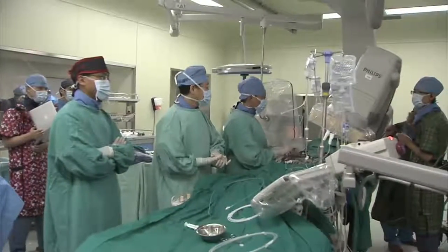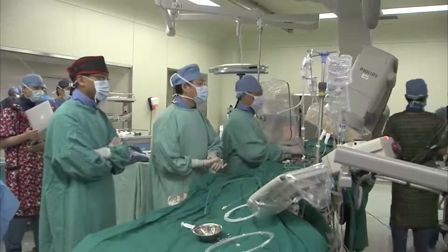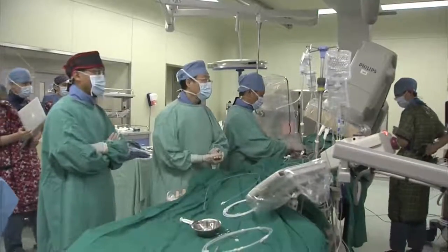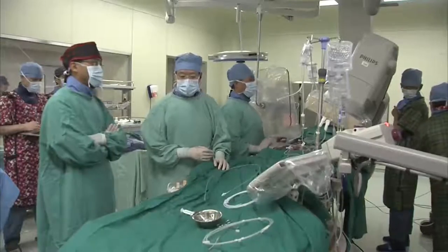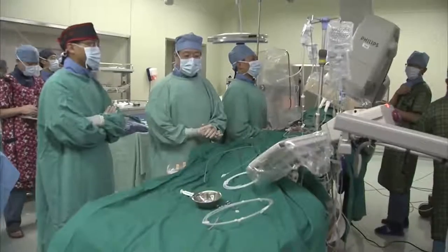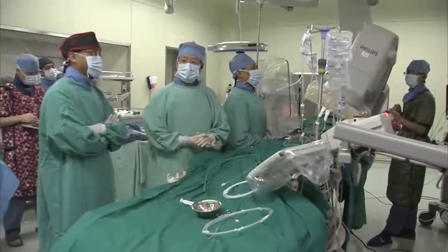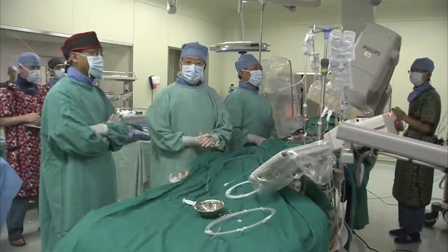It doesn't flare, so obviously I only see N of 1. It's kind of hard to know how it behaves in a less calcified valve, but it doesn't seem to flare until it releases to at least half before it opens up. So maybe Dr. Yang and Dr. Wu, when you put it in a less calcified valve, does it tend to, like CoreValve, open up and flare up more, or does it kind of constrain until you're halfway up before it opens up as one unit almost? The observation here is that it's constrained until you are pretty high up in terms of the sheath removal. I don't know the design, is it that way, or is it just because this patient had a very calcified valve?